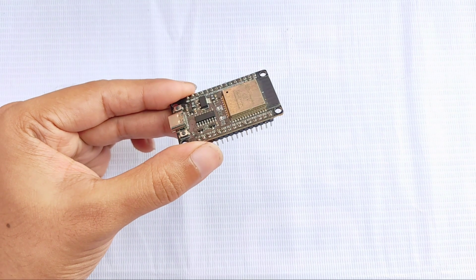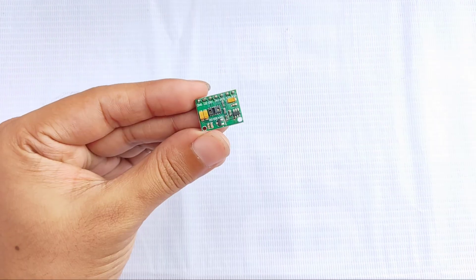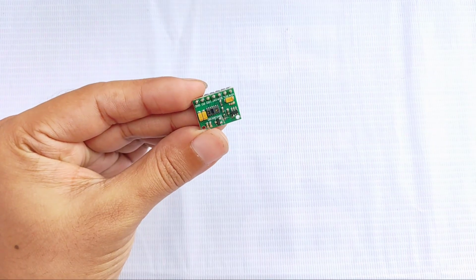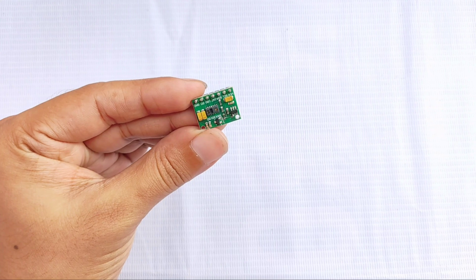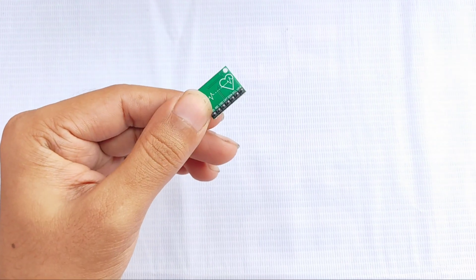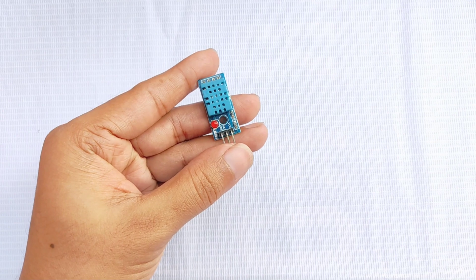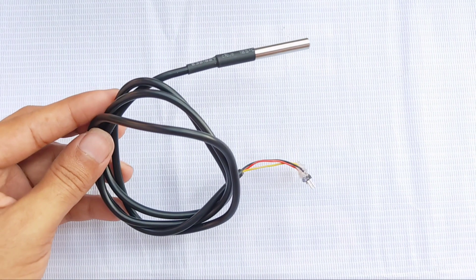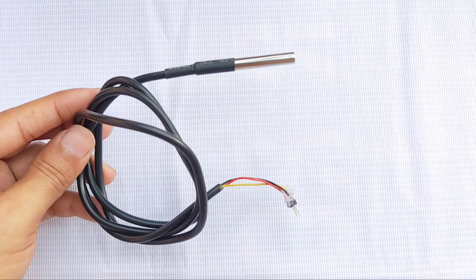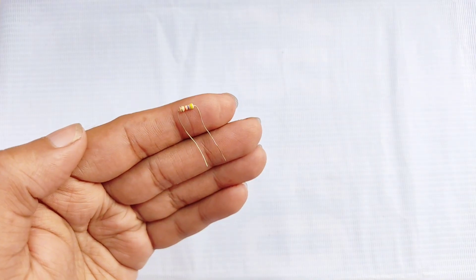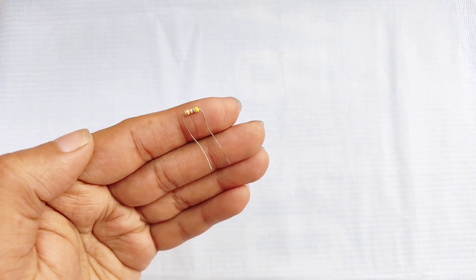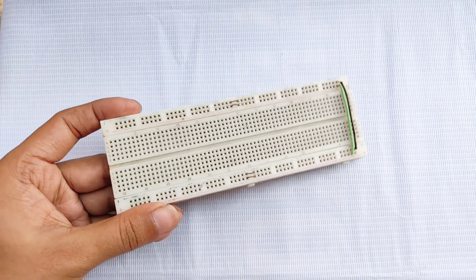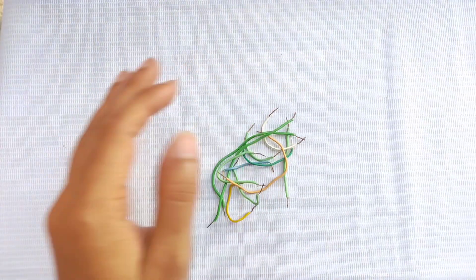First, we need an ESP32 development board as the main controller. For measuring heart rate and oxygen level, we'll use the MAX 30100 pulse oximeter sensor. To monitor room temperature, we'll use a DHT11 sensor, and for accurately measuring body temperature, we'll use a DS18B20 temperature sensor. Additionally, we'll need a 4.7 kOhm resistor, a breadboard, and some jumper wires for making the connections.